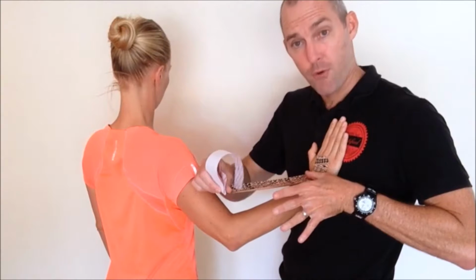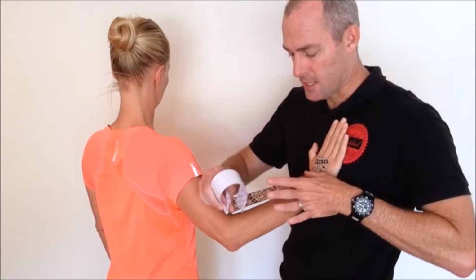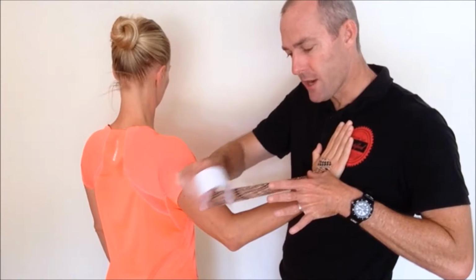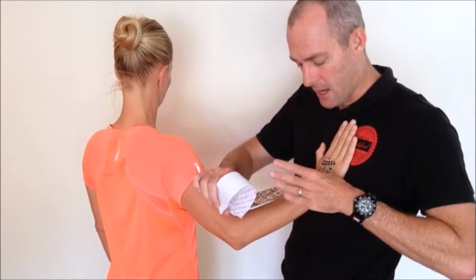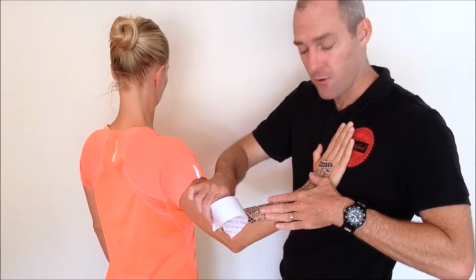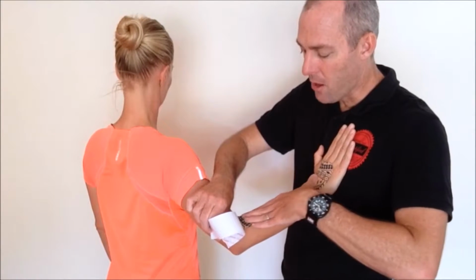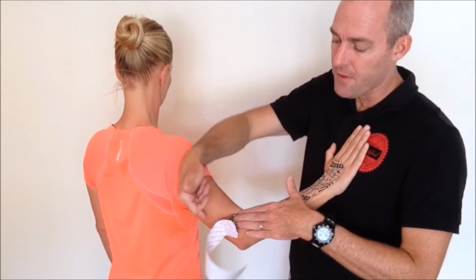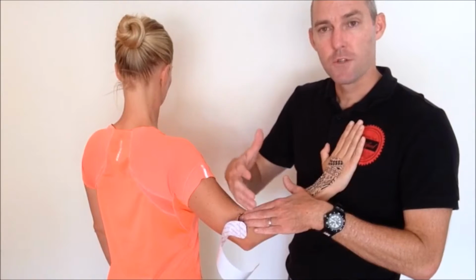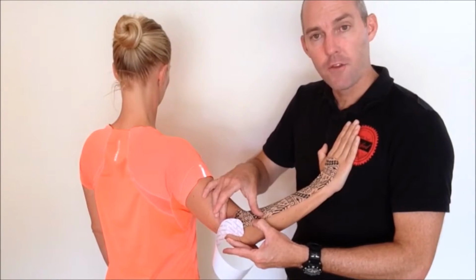Then we maintain our pressure on our anchor so that we don't get a reaction there. We take up the slack. Again, I'm not strongly stretching, I'm just taking up the slack along that whole piece. I'm using my thumb to anchor so that my fingers can smooth down once again. And then I'm applying it all the way along, and then I can apply this other end with absolutely no tension. You may want to bring in a soft tissue boxing, pinching offload at this end as well.